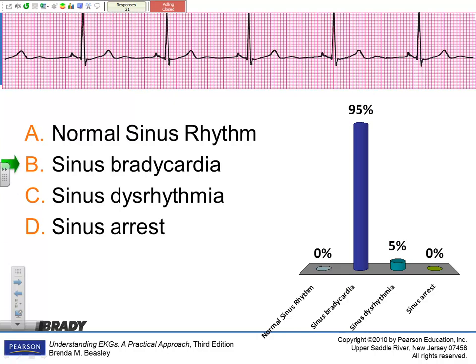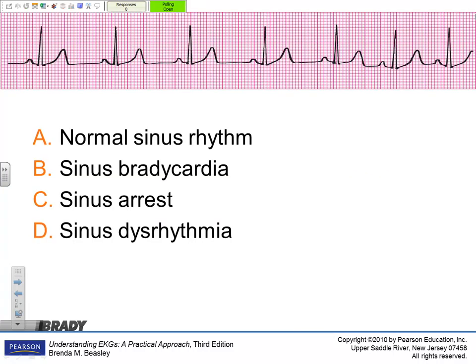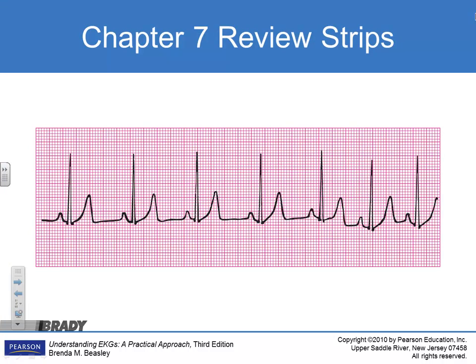You could, if this thing was slid over a little bit, you'd call it a sinus rhythm, I think. But technically, we've got sinus brady here. All right. Let me look at it there. Is it easier to see there? You can see the blocks.